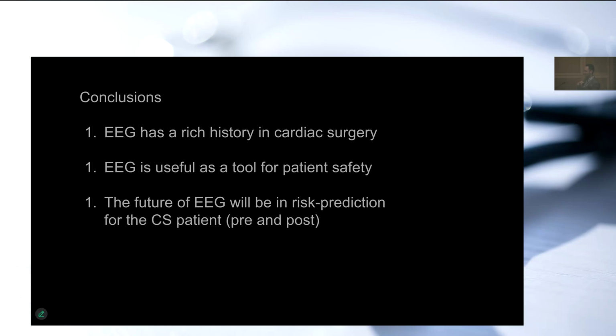For me, it's a little different because we also isolate the basilar when I do my cases, so I can't infer much about this for me. But if I see residual cerebral activity, I do increase my GABAergic drug to get isoelectricity. If that's not achieved through cooling, then I will make up the difference with drug, but I would also advocate for slightly colder. Occasionally we'll cool to maybe 32 degrees, and sometimes we'll go colder if the patient can tolerate it, and if we don't think the repair will be too long, then we'll do that.